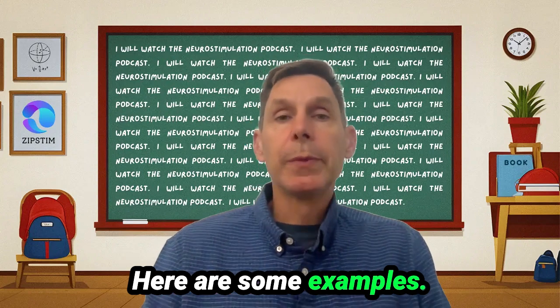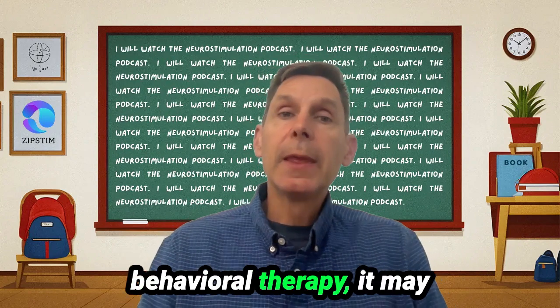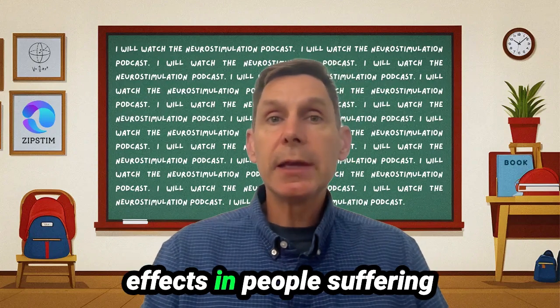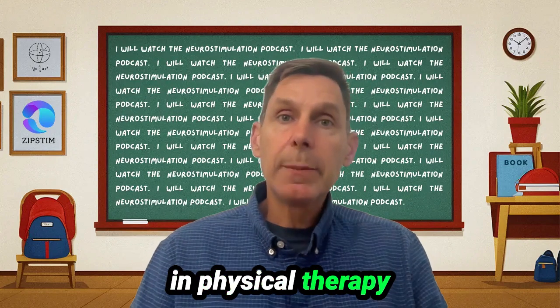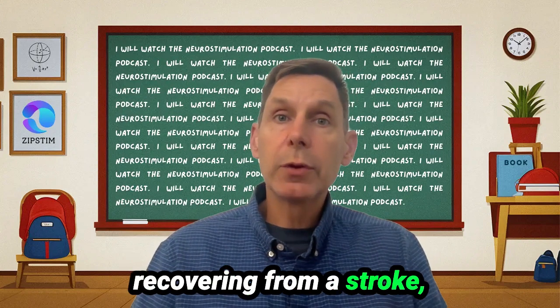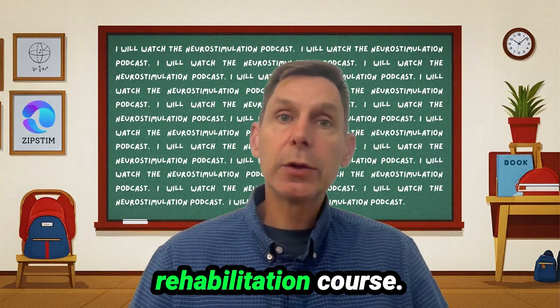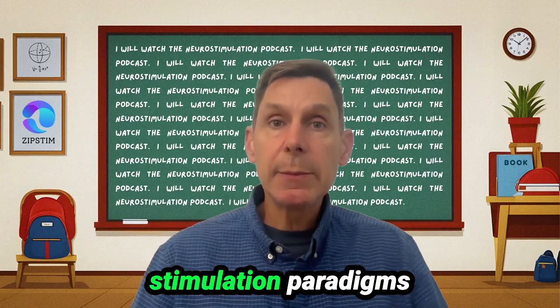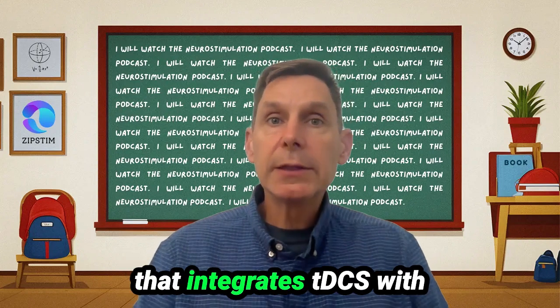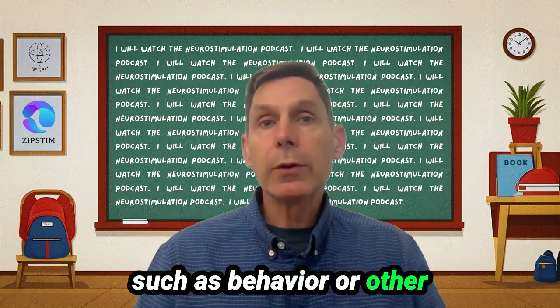Here are some examples. When tDCS is paired with something like cognitive behavioral therapy, it may increase the treatment effects in people suffering from depression. Or when tDCS is used during rehabilitation exercises in physical therapy settings, when a person is recovering from a stroke, it may potentially improve that person's outcomes during their post-stroke rehabilitation course. This insight appears to be shaping task-concurrent stimulation paradigms that integrate tDCS with other kinds of activities, such as behavior or other learning paradigms.